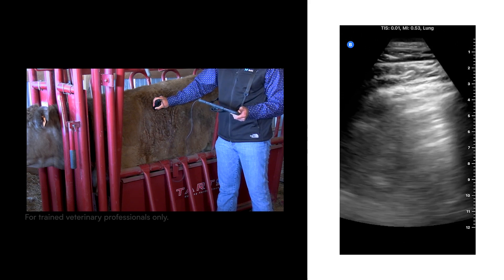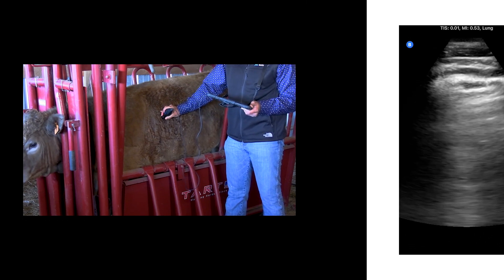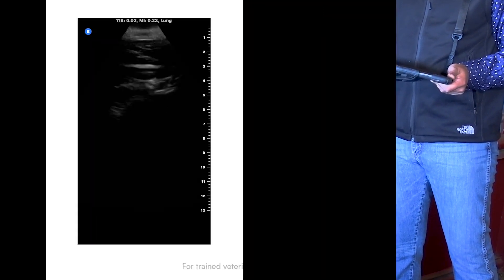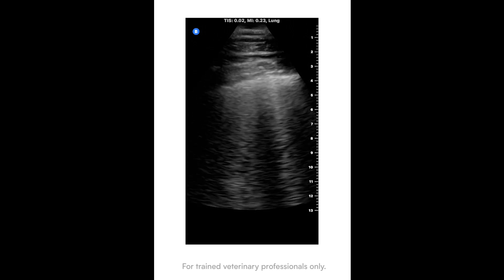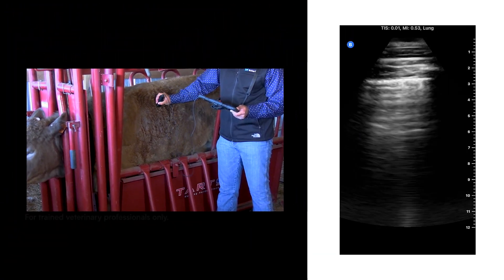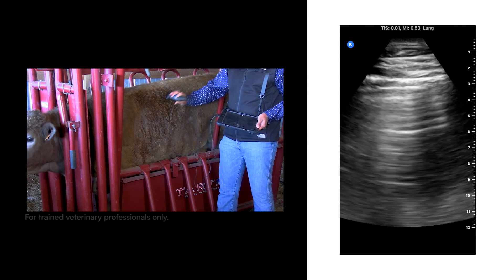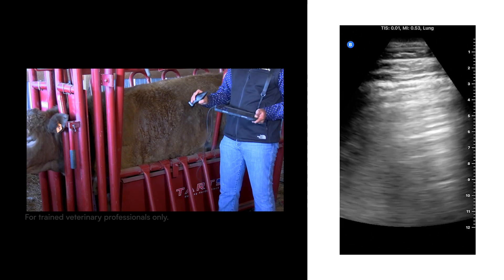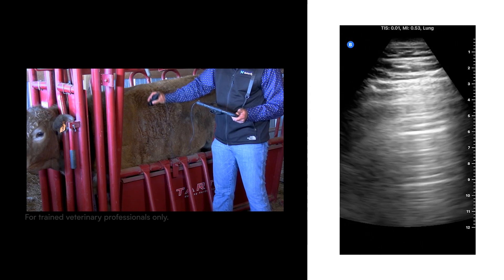You can see if there are any B lines present. B lines are an indicator of lung injury. They are lines that go vertically from the top of the pleural line all the way down through the image — they look like high beams from a car on a dark road, starting thin at the top and widening at the bottom. You go intercostal space by intercostal space scanning all the way down. Make sure you're fanning your probe — fanning means changing the angle of your probe — so you get to see more of the lung tissue.